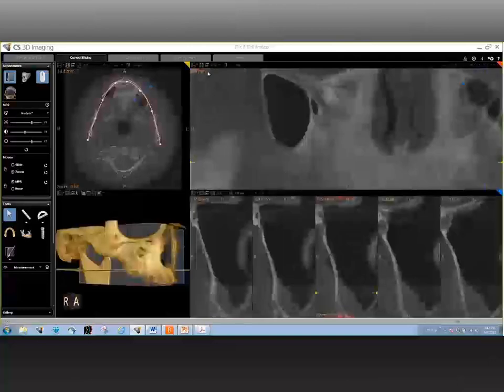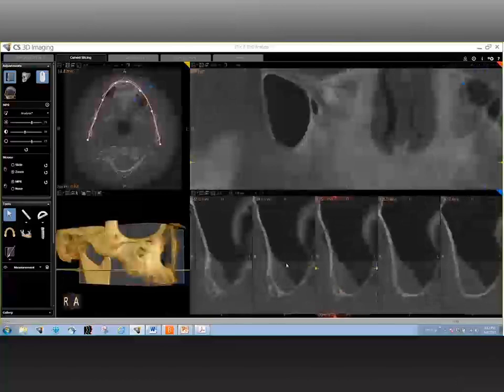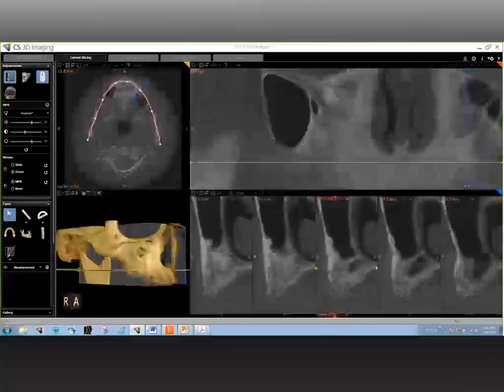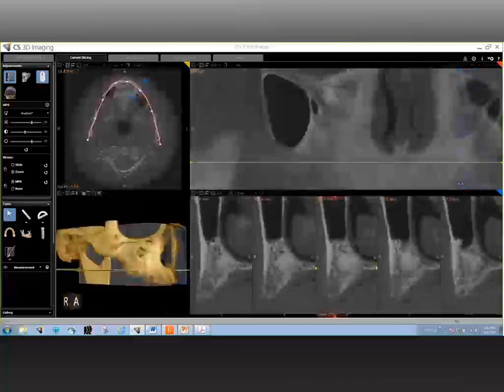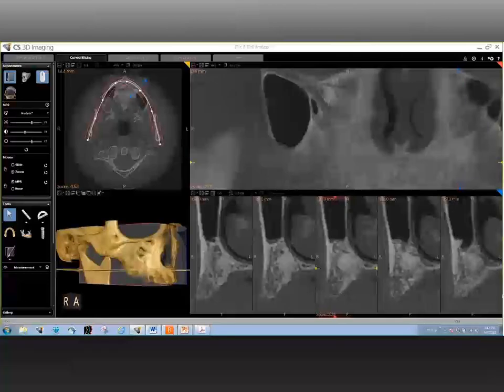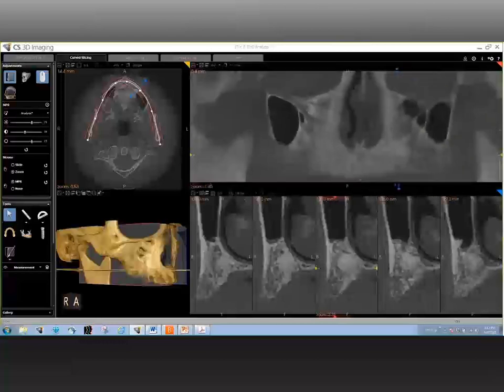I noticed something as you were scrolling through — does the bone look different on the contralateral side? You are correct — you have good eyes. That looks like some sort of graft procedure was done in that area, a small graft that seems to be osteointegrating. This also shows the importance of having CBCT images for pre- and post-graft procedures, where you can evaluate the area to be grafted, and post-surgically you can evaluate the osteointegration of the graft to the bone itself.